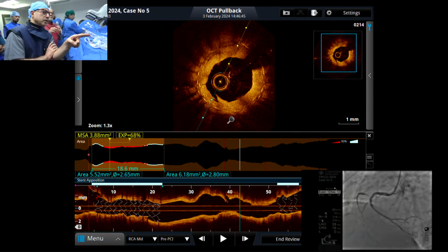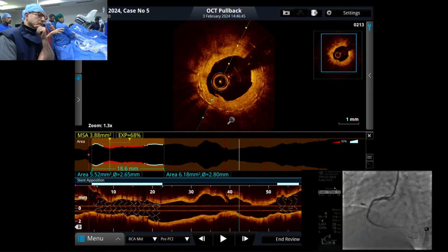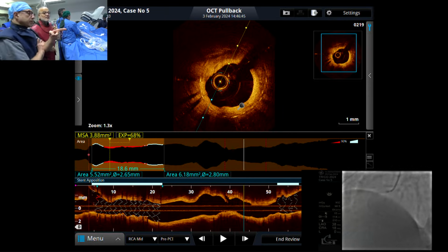Pressure came down. We are only giving adrenaline. Must be only vasovagal. There is benefit with the drug-eluting balloon, that too in homogeneous hyperplasia, not with heterogeneous.